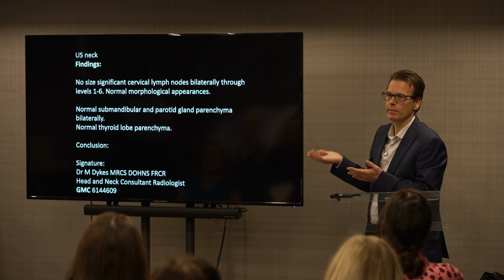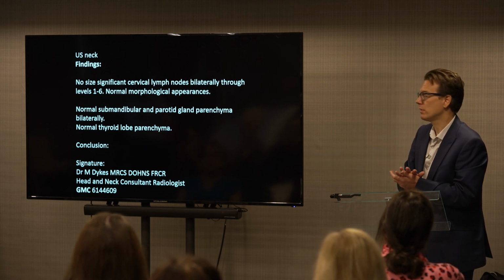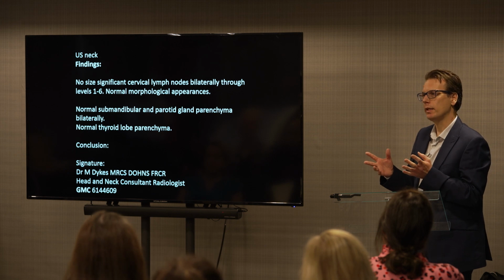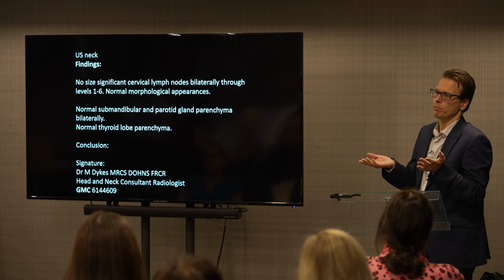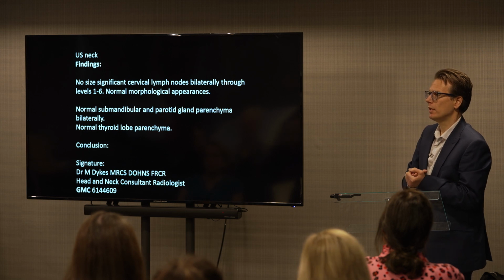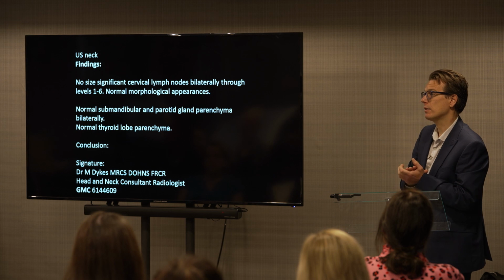So it's just something to bear in mind when you're doing this in your own practice. Just think about having some formal documentation, because obviously you can't take images normally if you're doing it in an ENT clinic, and it might be worth considering having the ability to print off an image to put into the patient's notes of something that you found, especially if you don't have the ability to put things through to PACS so we can all look at it.